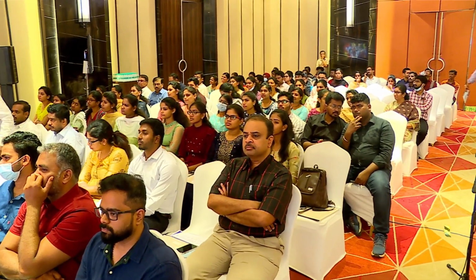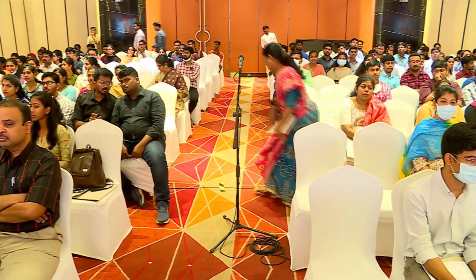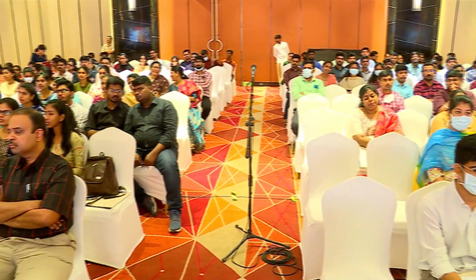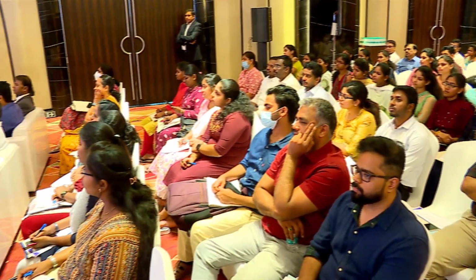Yes. So when the patient has pulmonary hypertension over a period of time and develops RV dysfunction, the TR velocity tends to come down when the RA pressure rises. So in that time, if we go by these numbers, we are likely to underestimate the severity of the illness in the presence of RV dysfunction. The presence of RV dysfunction indicates a grave prognosis, always. If there is significant right ventricular dysfunction, irrespective of the RV pressure, the prognosis is not going to be good.